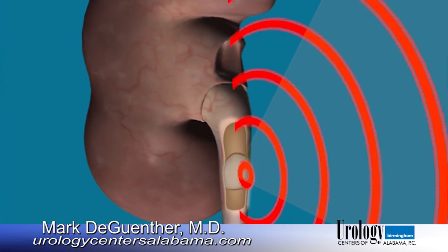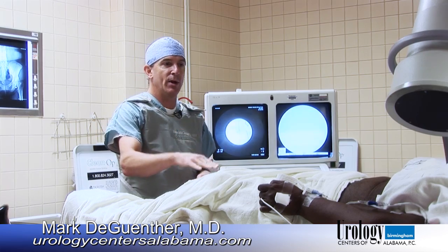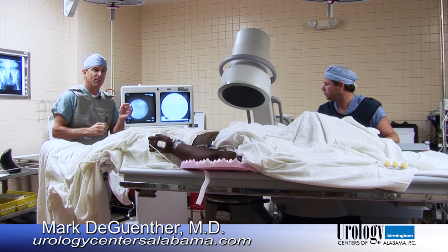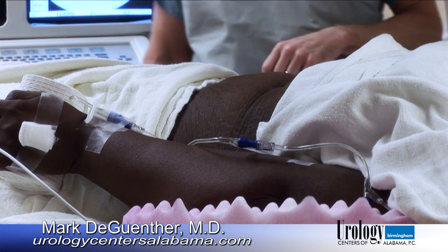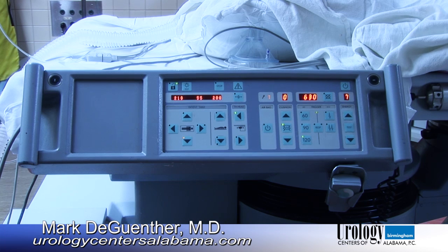The patient is laying on a table that moves up and down, back and forth, and then we adjust it in 3 dimensions to where the very tip of that cone is centered on the stone. What we see here, using real-time X-ray imaging called fluoroscopy, we are centering the crosshairs on this stone in the lower part of the kidney. And once we're satisfied that we have everything set up with the stone in the proper position, we will then begin creating the shock waves.